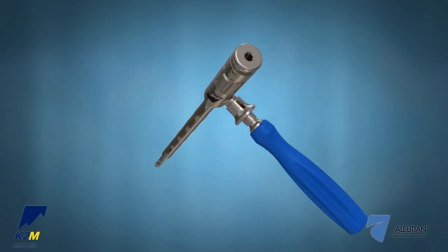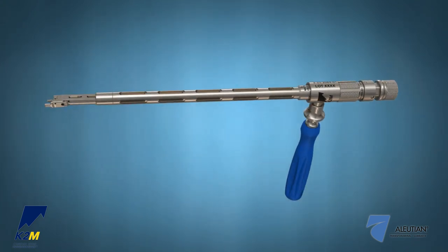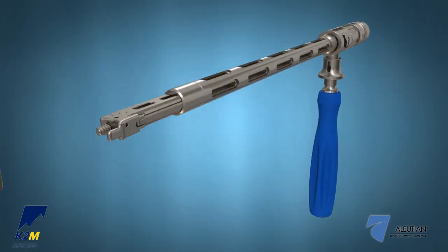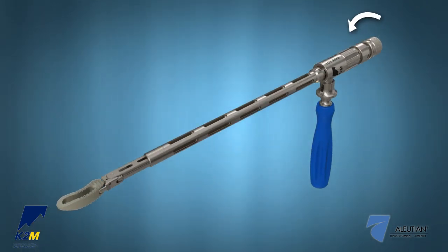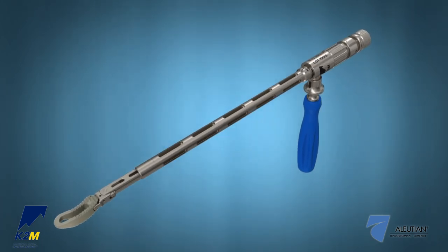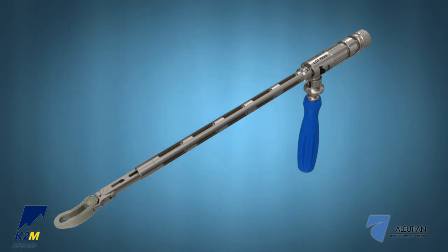If the adjustable inserter is used, insert the adjustable inserter inner shaft through the proximal end of the inserter. Attach the implant to the threaded stud at the distal end and tighten the implant to the inserter by turning the knob of the inner shaft at the proximal end clockwise. A torque limiter in the knob will slip when the implant is securely tightened. The inserter articulates from 0 degrees to 60 degrees by rotating the articulating joint thumb wheel at the proximal end clockwise, to aid in maneuvering the implant to the anterior portion of the disc space.